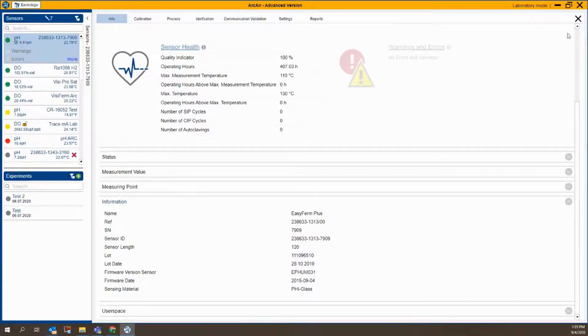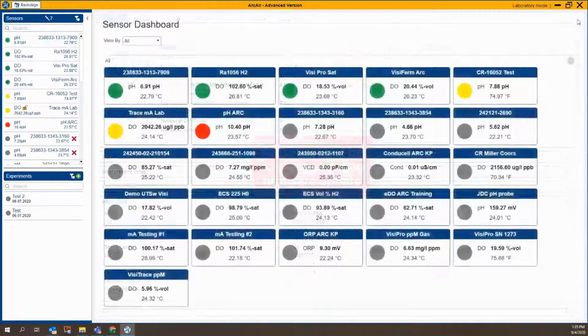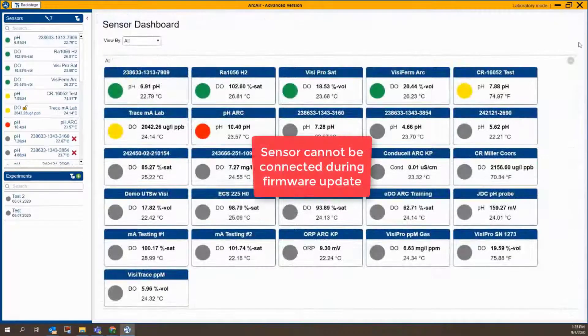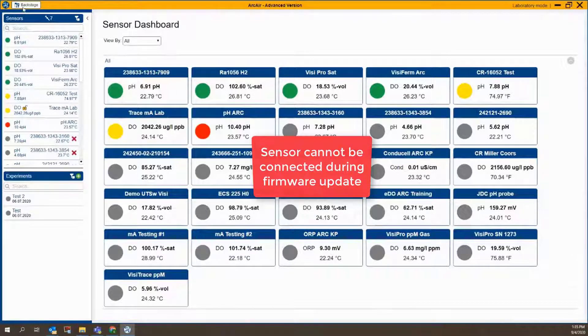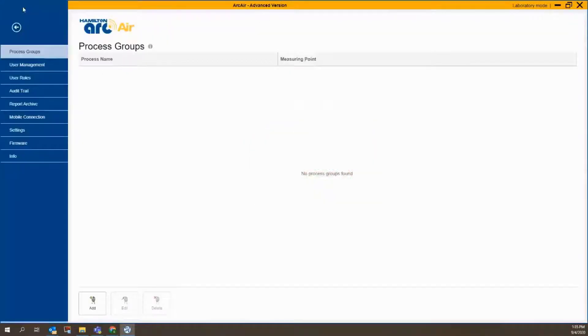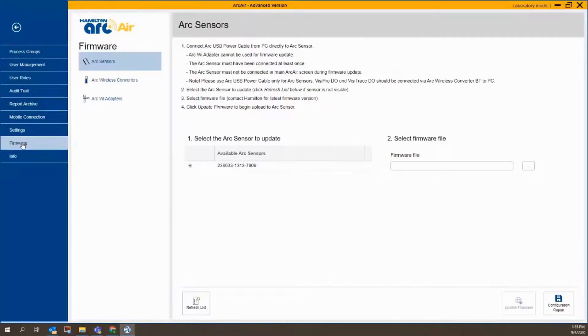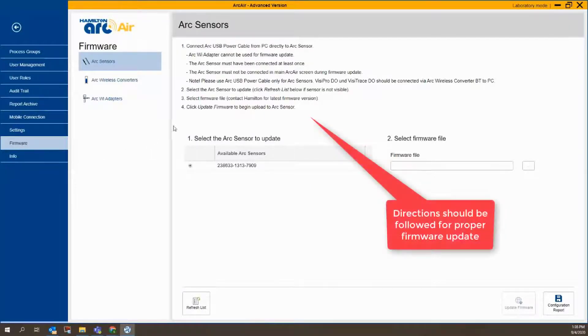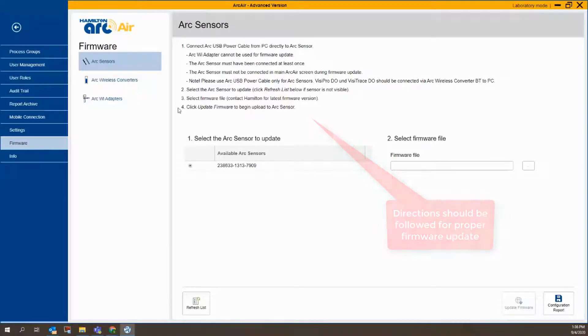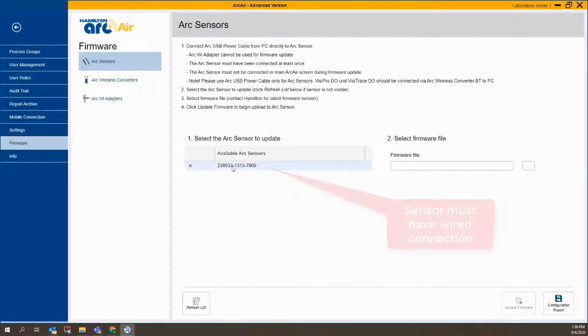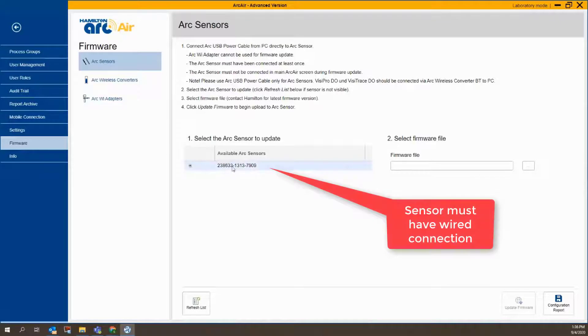So we're going to update the firmware. To do that, first off, I need to close the sensor, go to the Backstage, and go down here to this setting called Firmware. Now, if you're having any issues, there are directions here, and these are quite helpful. It automatically identifies the sensor since this is connected via the wired connection.